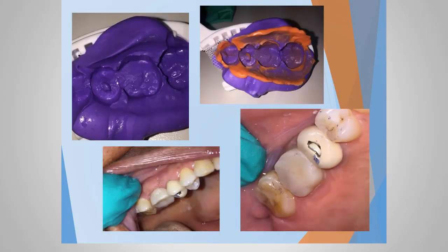As you can see here, this is tooth number 3, washed out buccal impression here, lingual impression here, buccal not too bad. I didn't take a burr to this. I just added some light body impression material to capture the areas that I didn't in the initial impression, and then we fabricated a temporary crown, as you can see here and here.